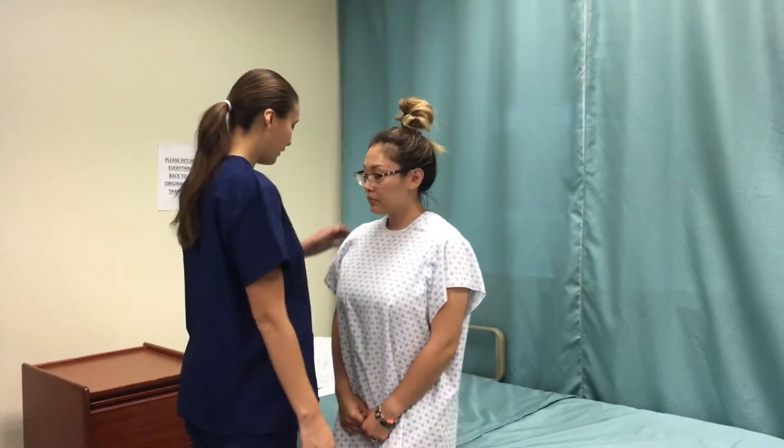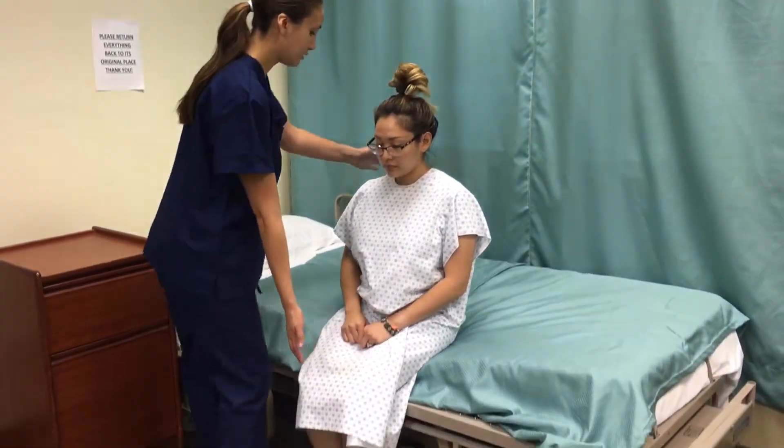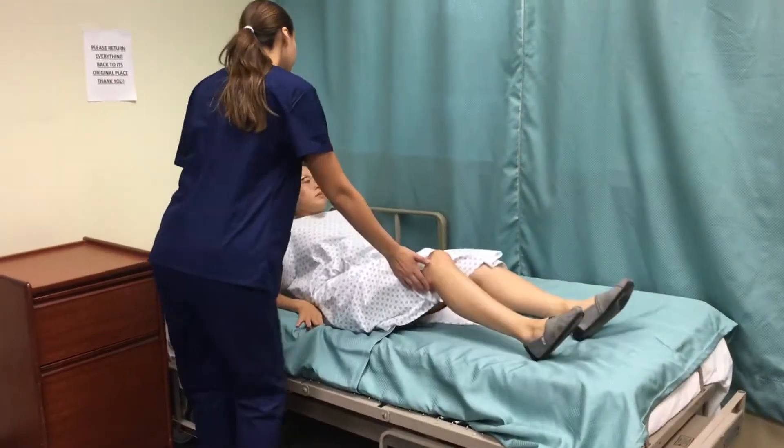Stand next to the scale and assist the client if needed off the scale before recording your weight. Walk your client back to bed and assist them into bed if needed. Then give them the call light and wash your hands.